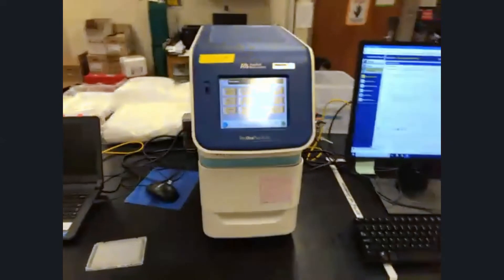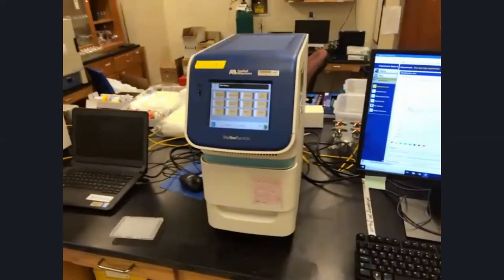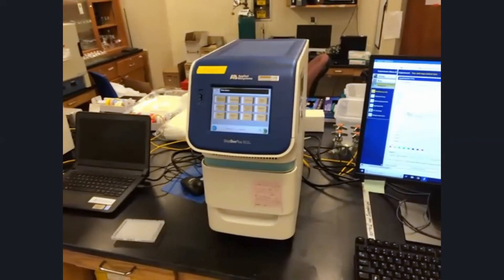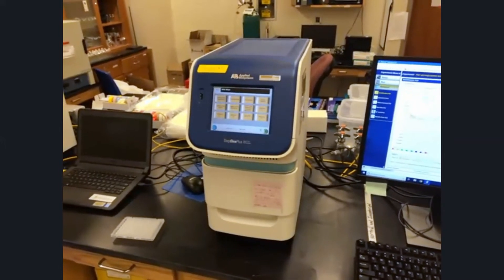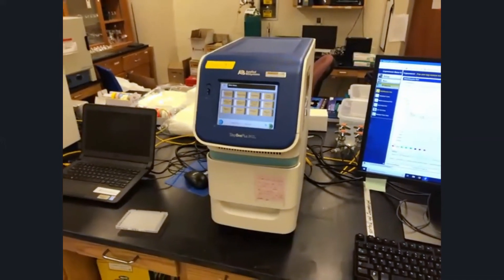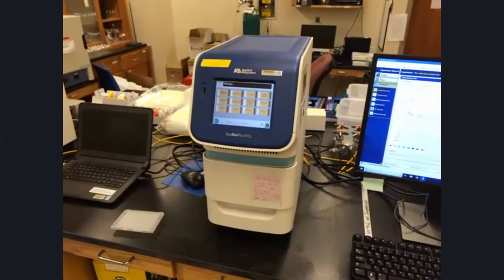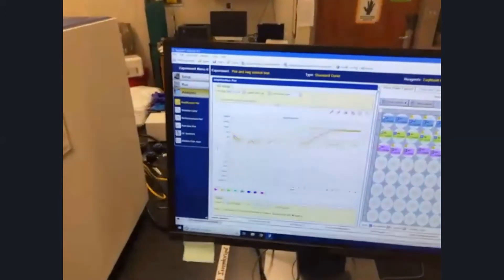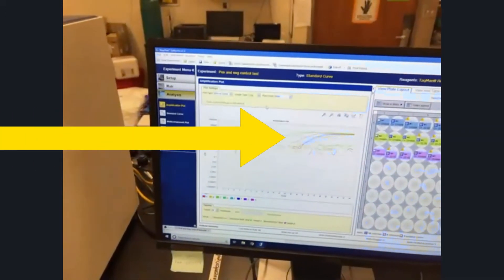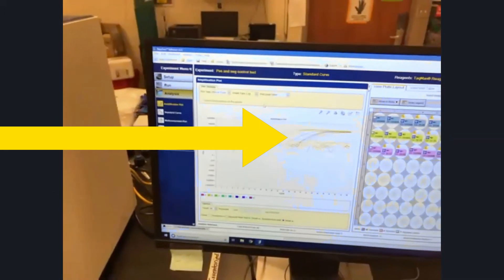It then gets loaded into this machine, which cycles through a variety of temperatures and amplifies specific regions. In this case, we're measuring for both the virus as well as human RNA, to ensure that we collected a sufficient sample. The output allows us to see signals — as these lines increase, that is the signal indicating we're able to detect the target we're interested in.